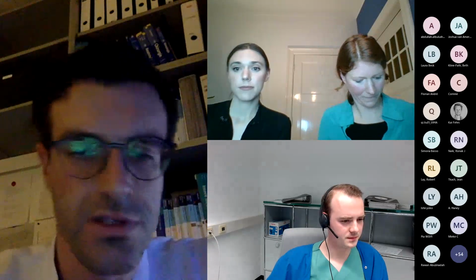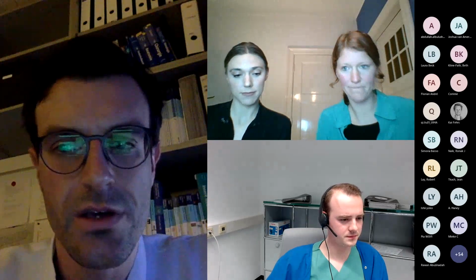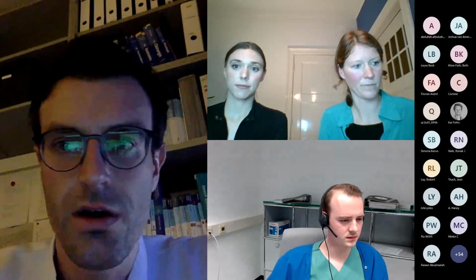Yeah. All right. There's another one. Does the pregnant woman always lay supine, or do you try side lying to make breath holds, etc., more comfortable for the patient? Who wants to answer? Yeah, I can start with my answer. So it's up to the patient as well. It's up to the patient if she prefers supine position or left lateral.